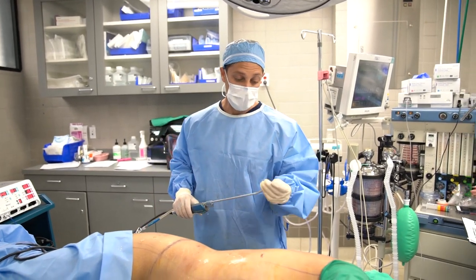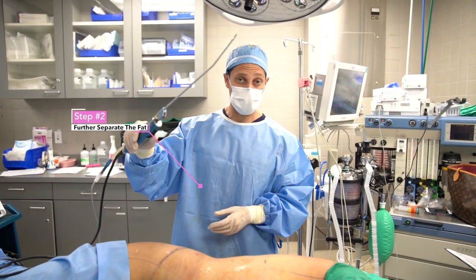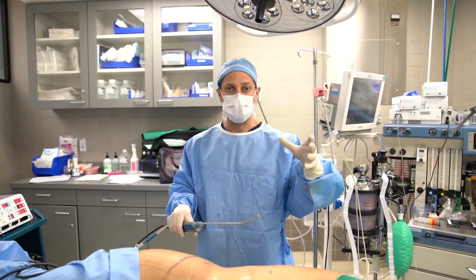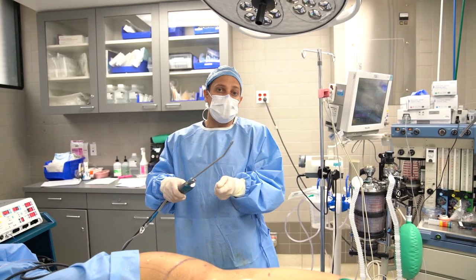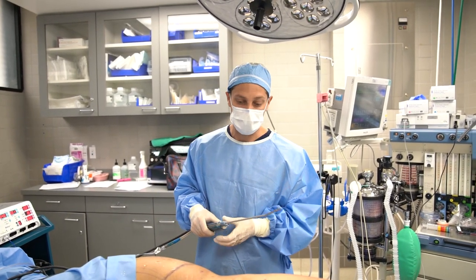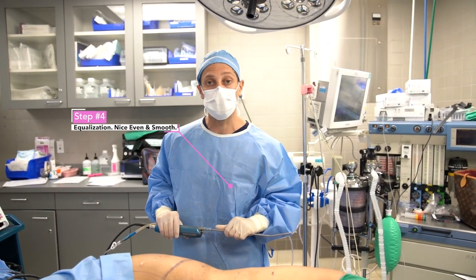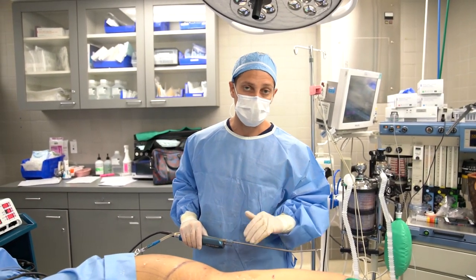Step 1 is SST. Step 2 is to go back and further separate the fat — you want to get the fat separated from all the adjacent structures because that allows it to be taken out very easily and smoothly. The third step is to actually remove it, and the fourth step, equalization, is to make sure everything looks nice, even, and smooth.